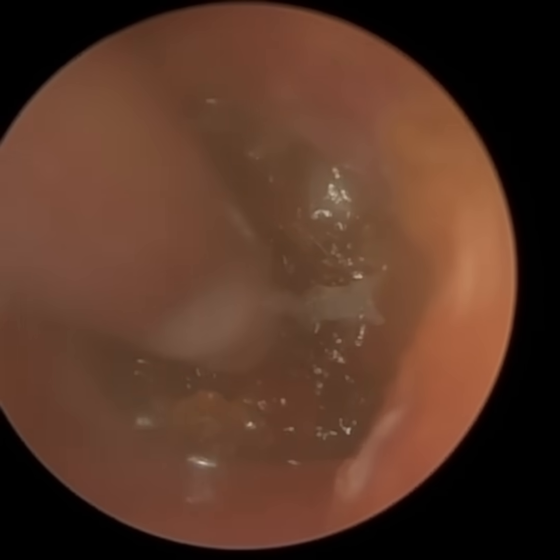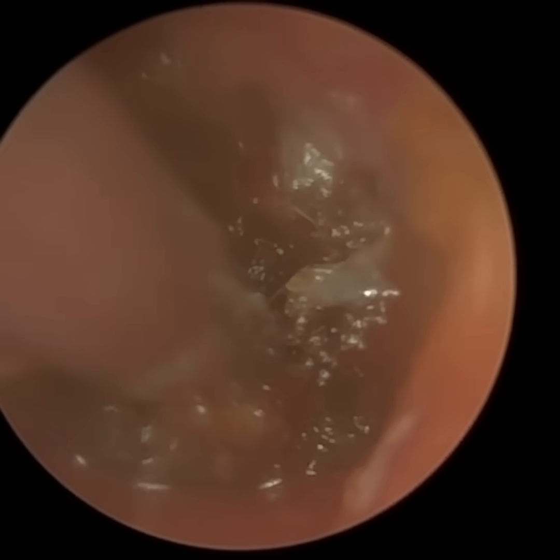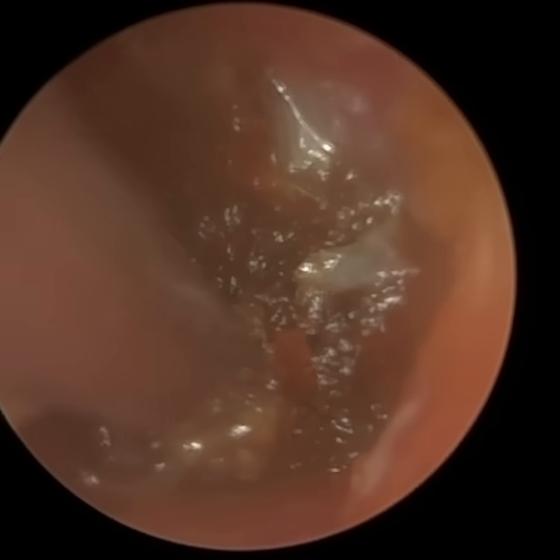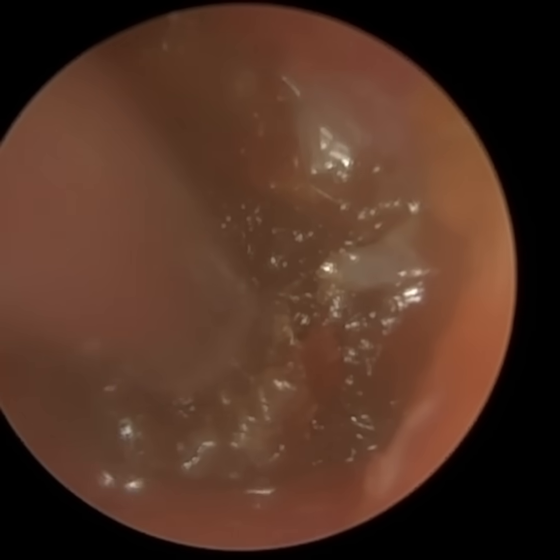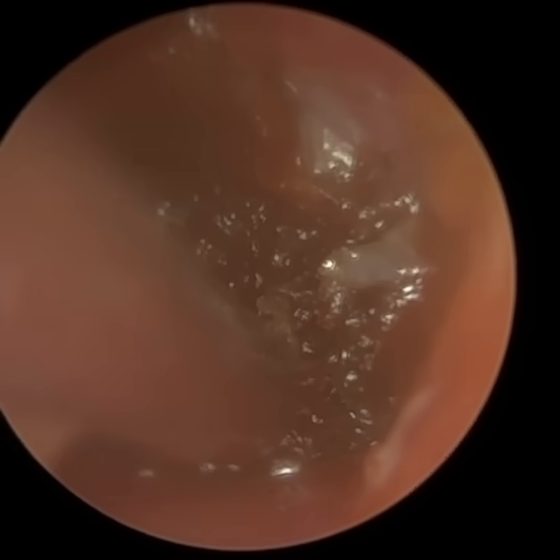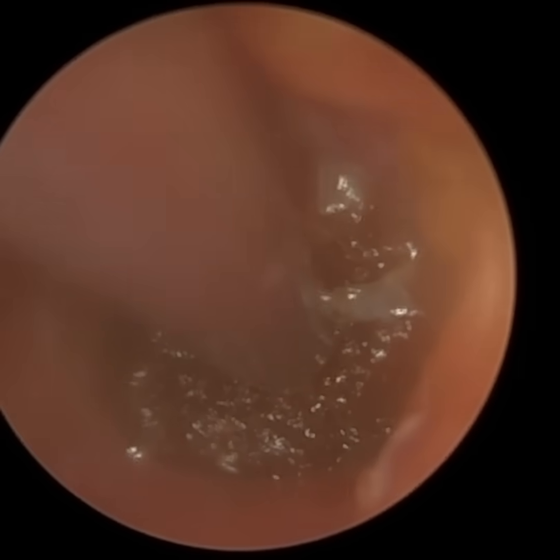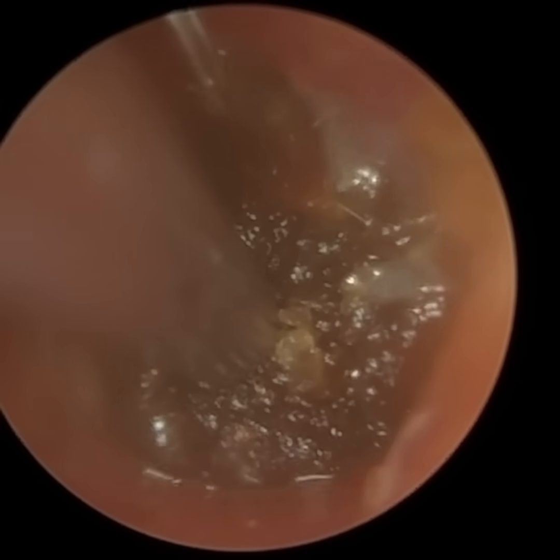So all the wax I've removed so far is using a fine end suction probe, which is actually an 18 gauge. Now, ideally, I would want something in between, because the 18 gauge, although you can see it has removed a lot of the wax, and it is extracting this wax that was on the patient's eardrum forwards, it just wasn't powerful enough. But the 14 gauge was too powerful because it was causing the canal to collapse when using the endoscope, and also it could barely fit into that space.